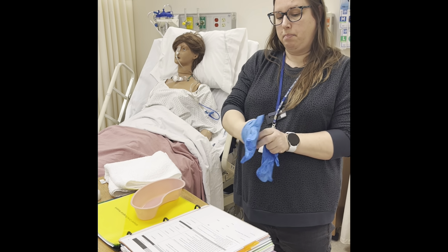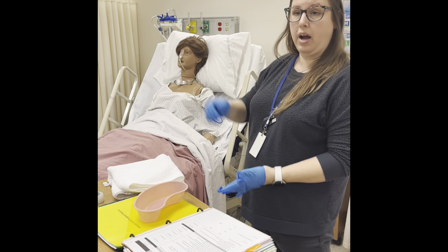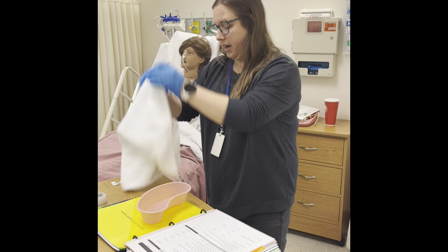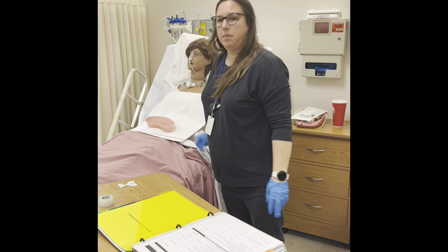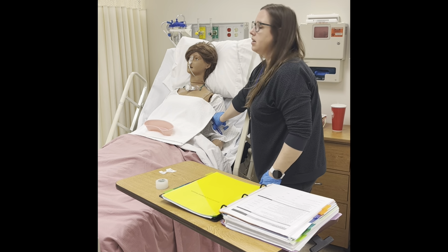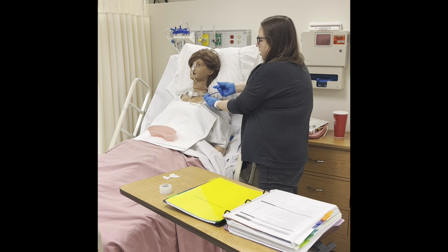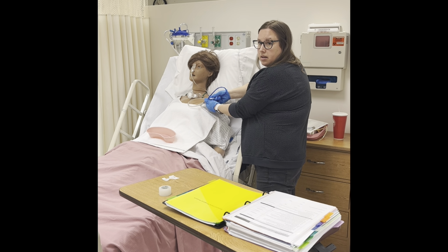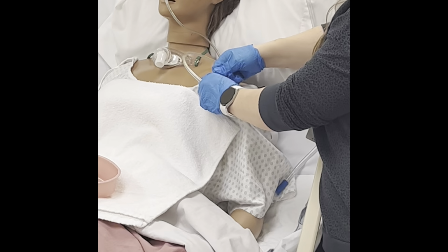Tells you to, again, put the clean towel over their chest. Make sure they're in semi-Fowler's or high Fowler's to prevent any aspiration. Again, in case they feel like they might throw up, we want to give them the emesis basin. We're going to start disconnecting everything. So if this vacuum was connected, we would disconnect it and then connect our tube together so it's anchored off. We're going to unpin it from the gown.